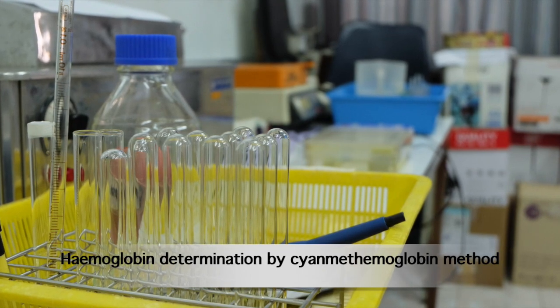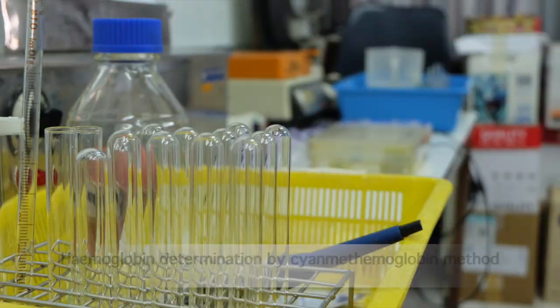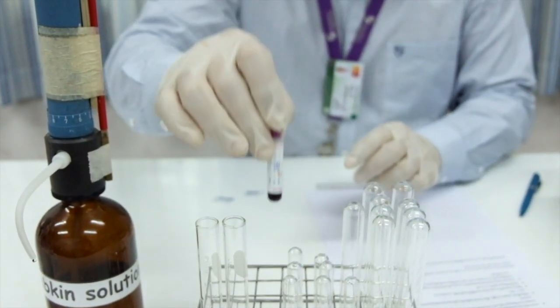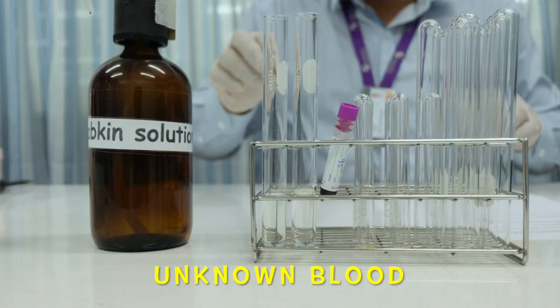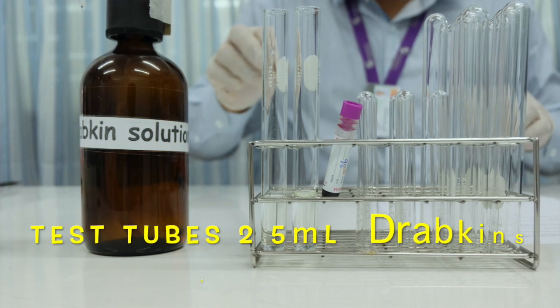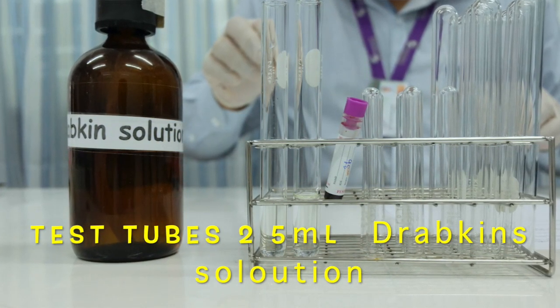Hemoglobin determination by cyanmethemoglobin method. To determine the level of hemoglobin, cyanmethemoglobin is chosen in this experiment. You receive an unknown blood in a collection tube coated with anticoagulation agents from the hospital.